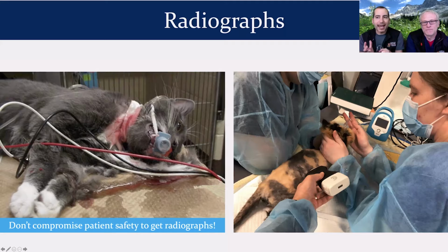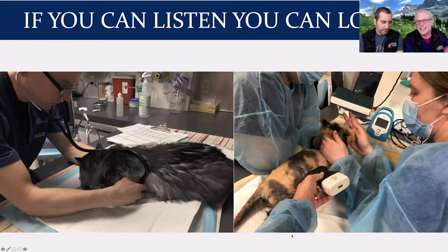There are so many applications, Dr. Boysen. I love your saying about this. Yeah, absolutely, Dr. Chalhoub. If you can put a stethoscope on it, if you can listen, you can look. And you can see there's no more stress in holding a stethoscope, or in this case, there's probably even less. You're actually reaching in.